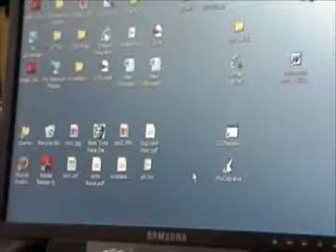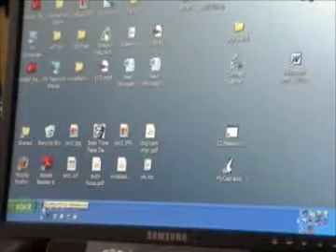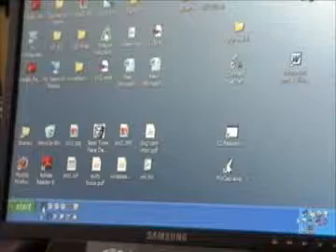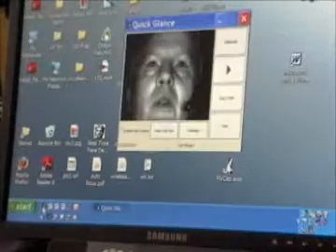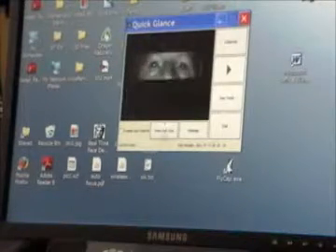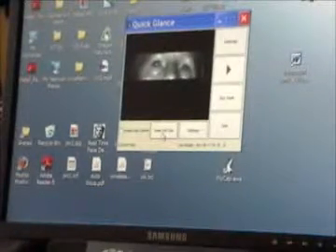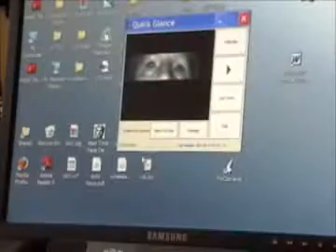The first thing we want to do is start the Quick Glance software which controls the TM3 eye tracker. It comes up and brings up a live video image showing my eyes.